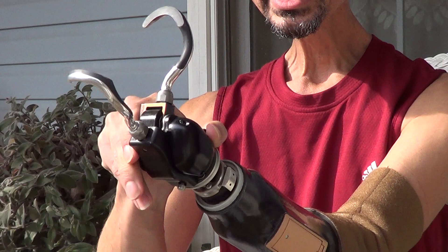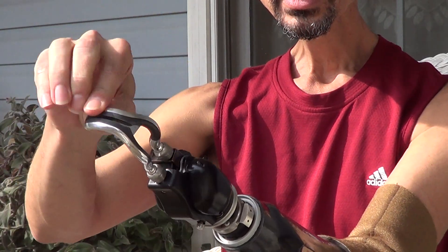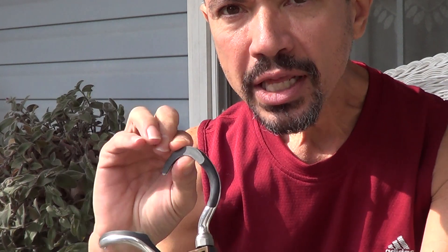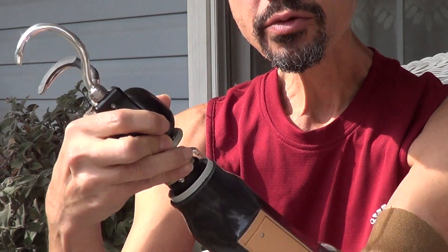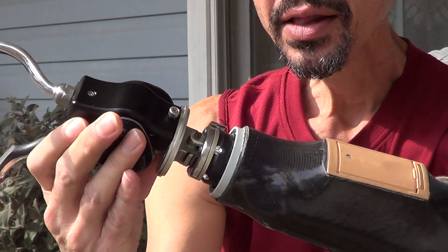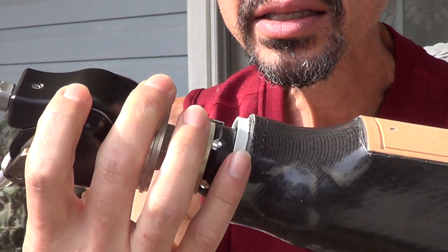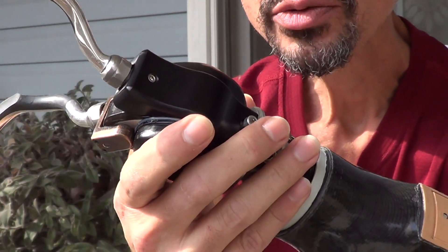It has an emergency release that I flip like this, and it makes it so that this right here isn't engaged anymore. And you can turn it off with another switch on the inside here — this is a switch to turn it on and off, so it saves the battery power.